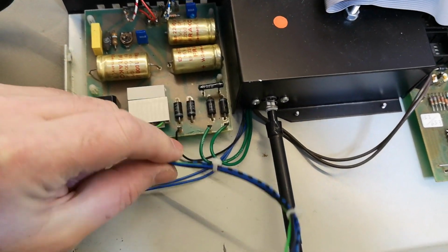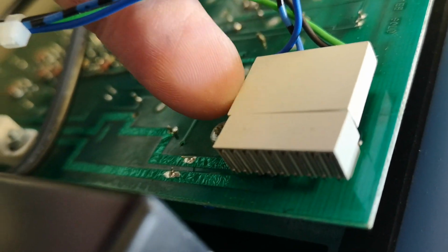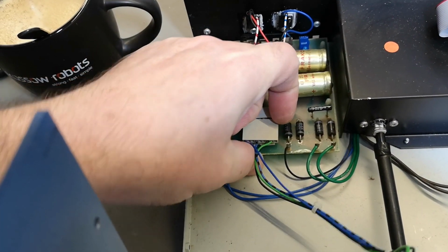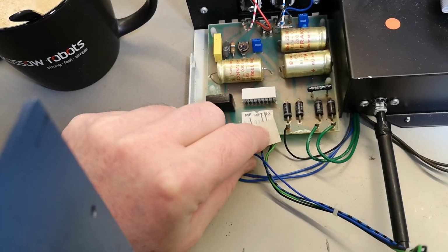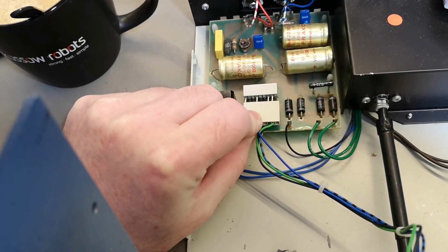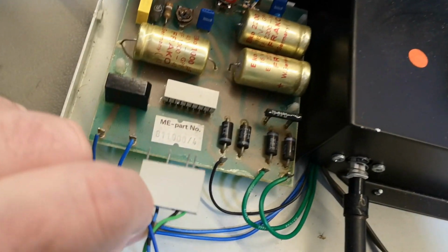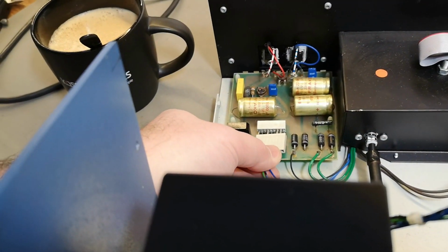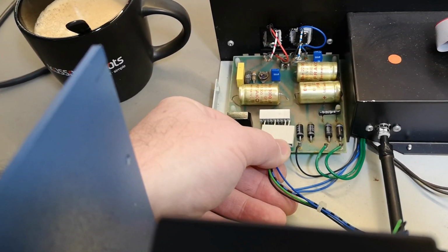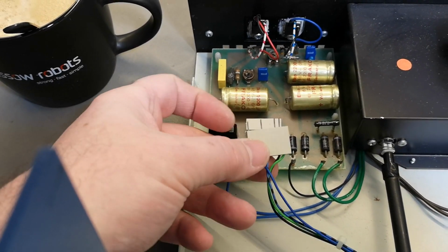Look at that. So this is the connector for the printer. But here it looks like there's a match, right? Okay. So how was that? It was like that, right? There is some stuff sticking out there. This is maybe to avoid you can stick in this wrong. So somebody put in 2 pins inside the holes. That's actually smart.